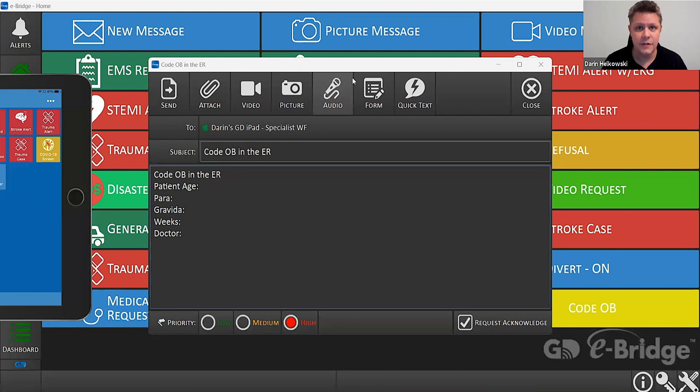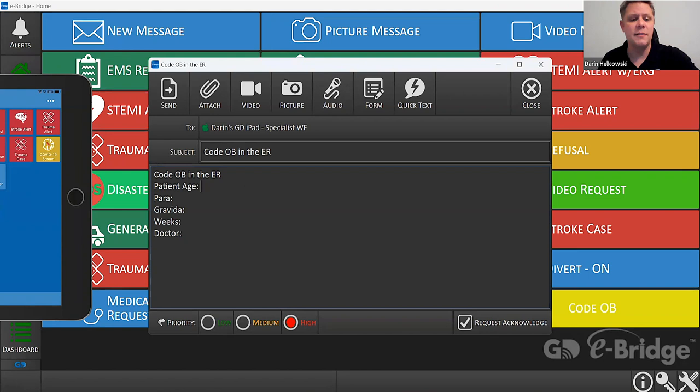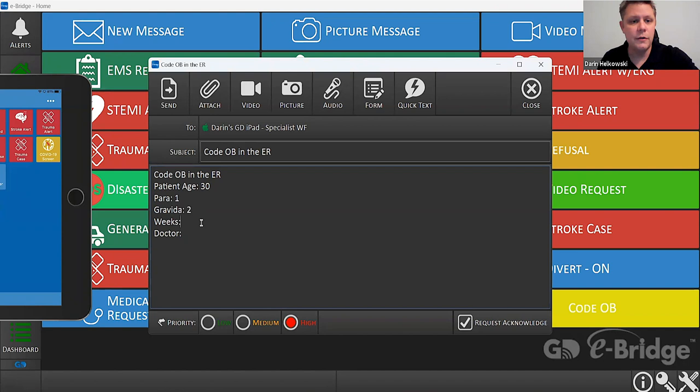In this case we're just going to do a fire-and-forget — almost like sending a text message up to the OB unit to let them know you have a patient. We'll enter some basic information: a 30-year-old, para one, gravida two, 30 weeks along, and their doctor is Dr. Smith.